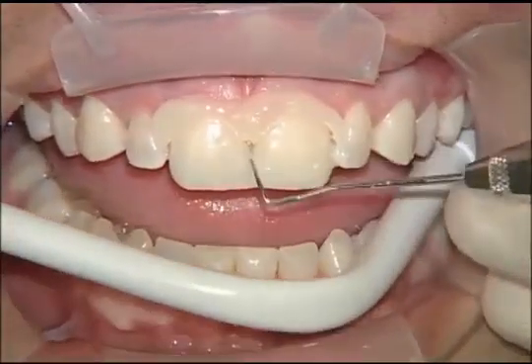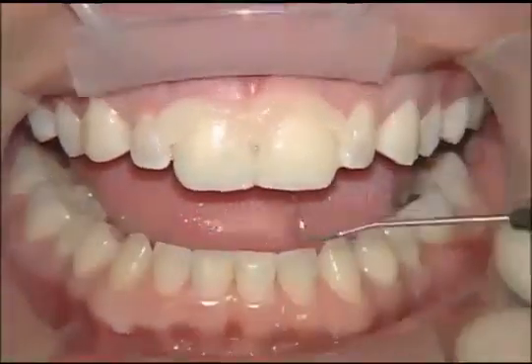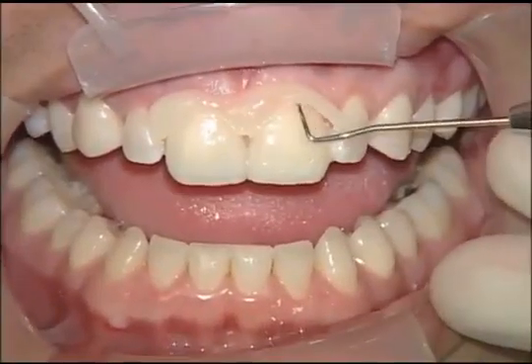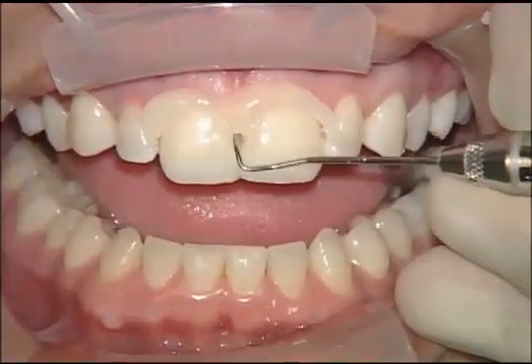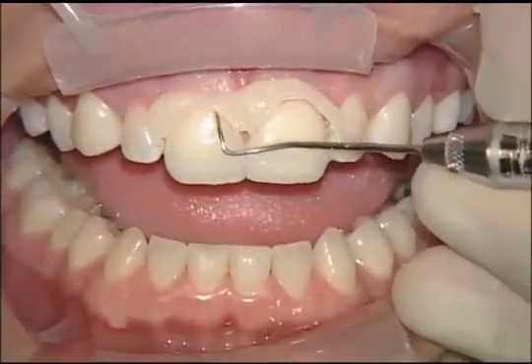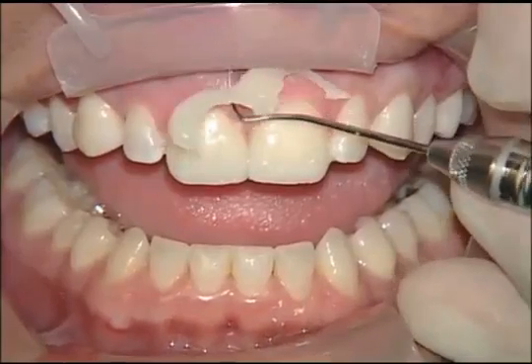This is nice because this is the way we're used to cleaning up crown and bridge cases when we use conventional crown and bridge cement. In this case, we're doing veneers, and veneer cleanup is typically one of the harder things we do in general dentistry. And this tack and wave technique of removing this entire piece of cement at one time, as we've done here, really makes things a lot easier.